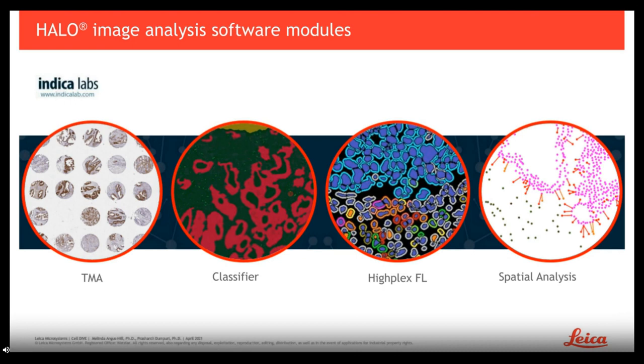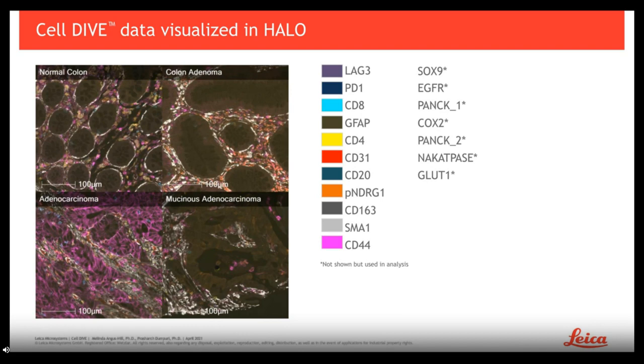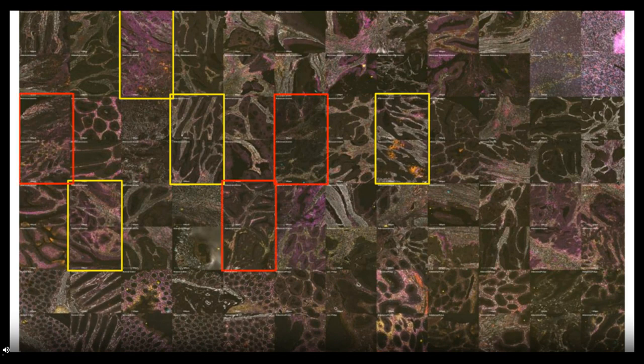HALO is used as an image viewer but is also powerful for image analysis. For classification, segmentation, and spatial analysis, several HALO modules were used, including the HALO TMA, classifier, HyPlex FL, and spatial analysis modules. Here, zooming in on specific cores in the TMA, HALO displays cell staining across multiple markers in colon adenoma, adenocarcinoma, mucinous adenocarcinoma, and normal colon. Here is a zoom of each tumor core within the TMA compiled in an 8 by 12 format. Tumor cores from the same patient are easily identified across pathologies — highlighted in yellow are adenocarcinoma cores from the same patient that are qualitatively similar based on biomarker expression, while boxed in red are adenocarcinoma cores that are qualitatively distinct within the same patient, possibly due to intratumoral heterogeneity.